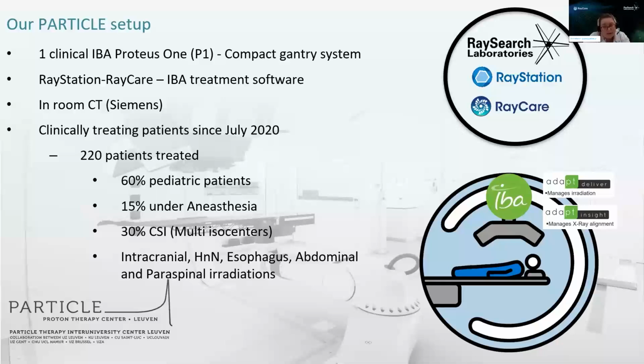Also quite notably, we treat a lot of craniospinal irradiations, so our CSI, so that's about 30%. I would say that's kind of our specialty, at least that's how it feels like. And apart from CSI, we also do general intracranial irradiations, head and neck cases, sporadically. We also do esophagus patients within the PROTECT trial, and apart from that, also abdominal and paraspinal indications.